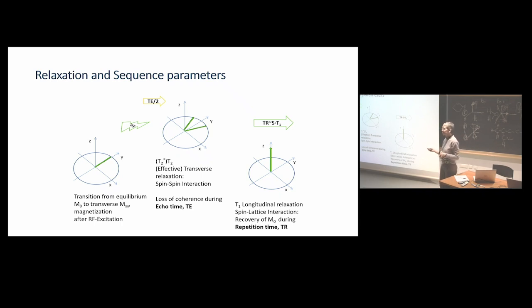So you see, then we have to repeat that to get an image, and an image is between 64 and 256 repetitions. So you see, everything is getting really slow if we respect this limit. MR people usually don't respect that limit, but in principle, it's there.